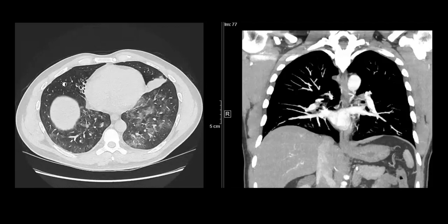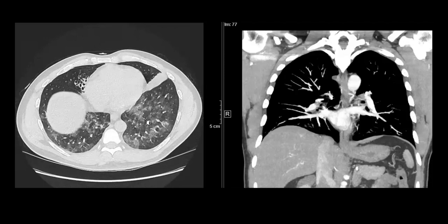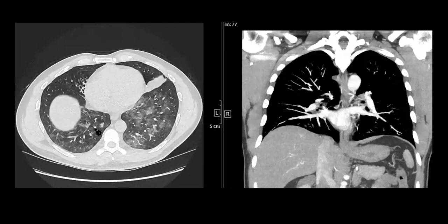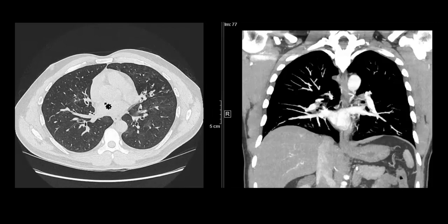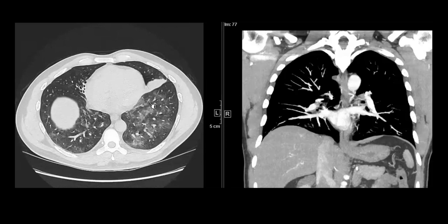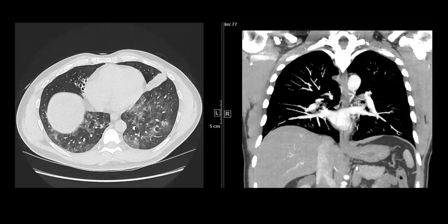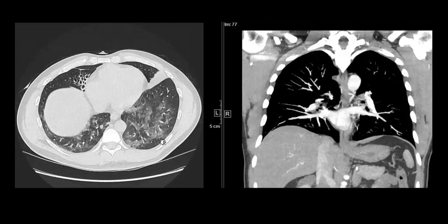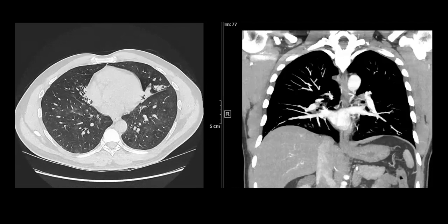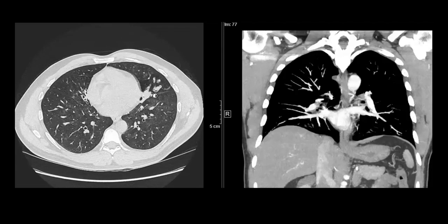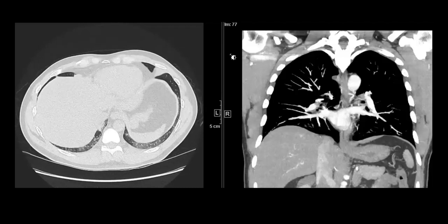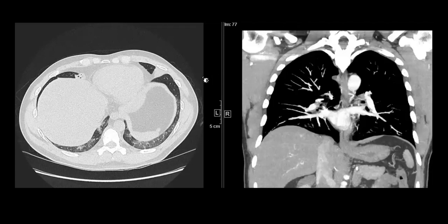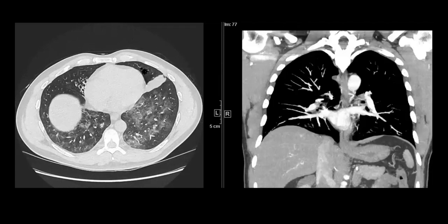What we see is, as you rightly pointed out, there is bronchiectasis. And yes, there are diffuse patchy ground glass opacities which are predominantly basal, but we also see some of them in the lingula and right middle lobe. This was the case of hemoptysis and the differentials for this finding included diffuse alveolar hemorrhage. The patient also had bronchiectasis. I'll just open the soft tissue windows.